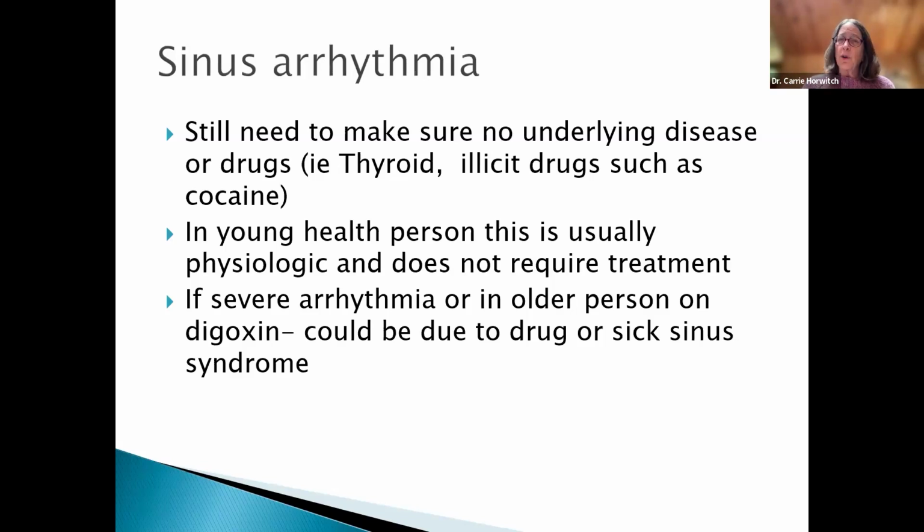If you see this in an older person, you need to think, are they on digoxin? Digoxin can cause all kinds of arrhythmias. Or could this be some sort of sick sinus syndrome, or the start of that? That may be somebody who needs further looking into.